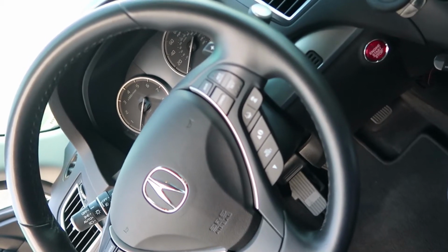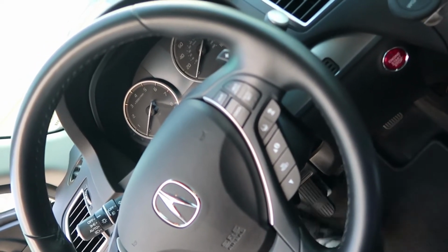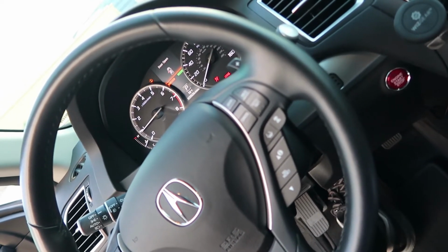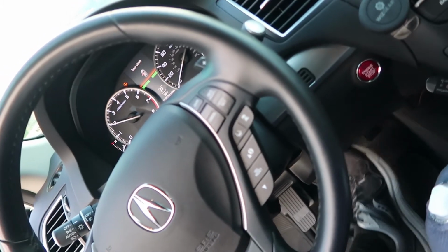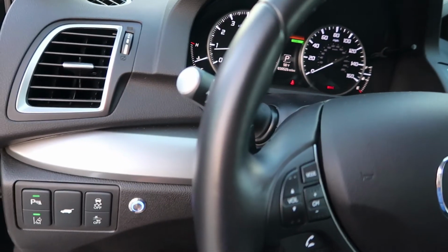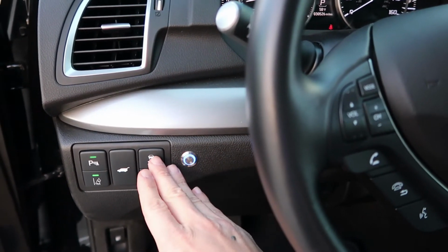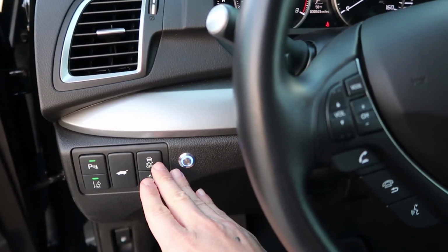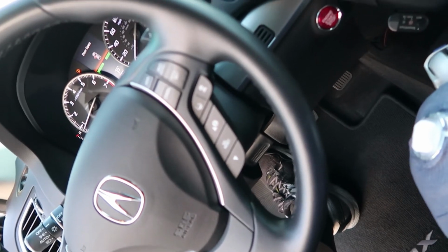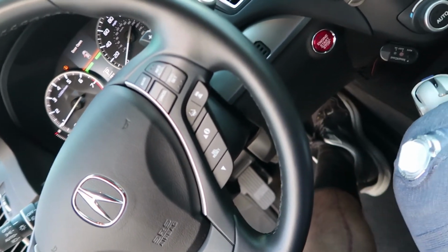Now this system comes with a safety feature called autolock. What that means is only one accelerator is engaged at a time. So when you first start the car, it always starts off with the factory settings, meaning the right accelerator works, but the left one does not do anything. You have to press this button within 30 seconds of first starting the car, and if you do, it stays blue. The beeping you just heard is a 15-second reminder. Now if the light is lit blue, that means your left pedal is engaged and the factory right accelerator doesn't do anything.